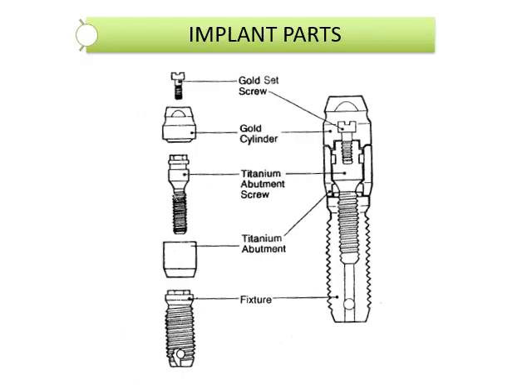Okay, you definitely want to memorize the different parts of the implant itself when we're talking about the endosseous implant, the most common. And you want to know where the fixture is, which is the root replacement. And then you want to know about the abutment. And the abutment sits on top of the root replacement, the fixture. So on this slide right here, you want to know that there's a fixture and there is an abutment.